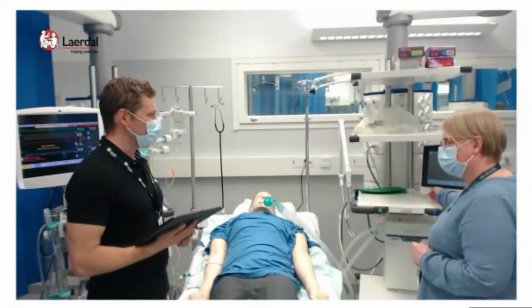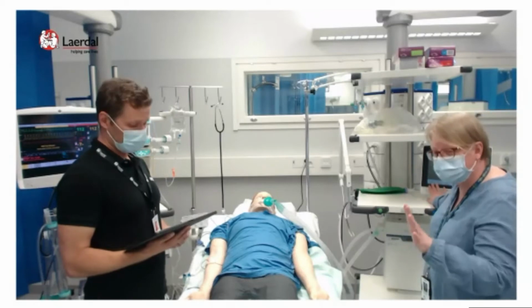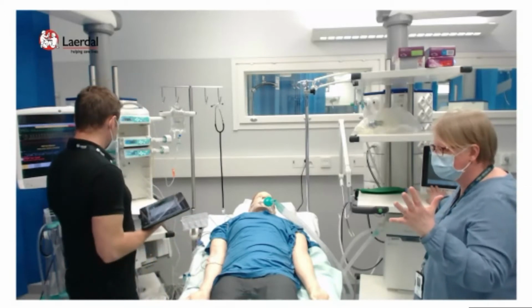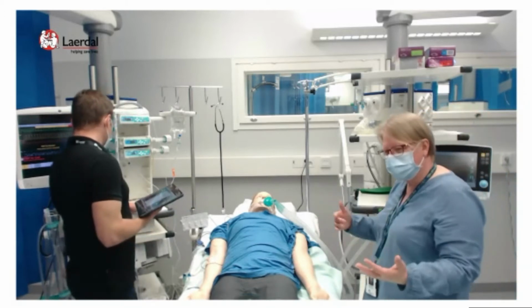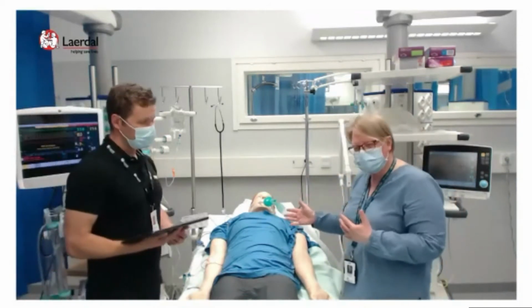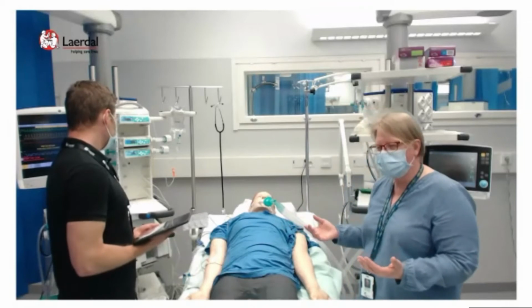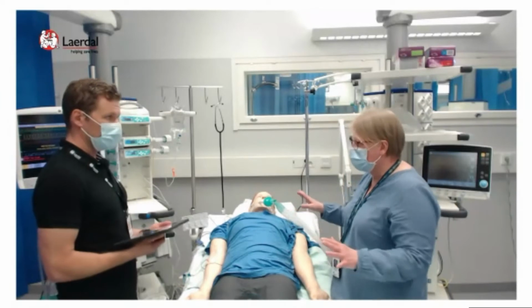I will change the FiO2. In the beginning it was 50%, so I would change it to maybe 60 or 70% from here. And because the patient is breathing, he's doing a lot of breathing work. He's restless. I would give him sedation, fentanyl 50 micrograms from the beginning, maybe midazolam 1 milligram, and see what effect that has. Does he calm down?